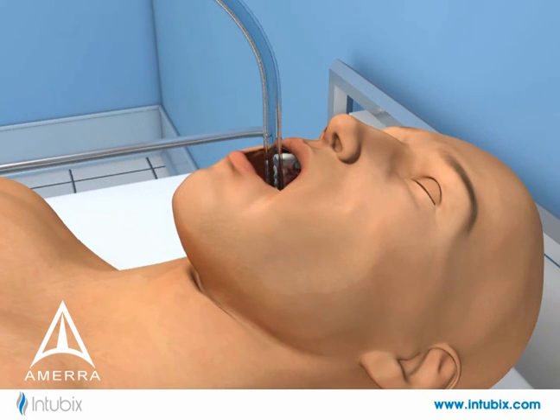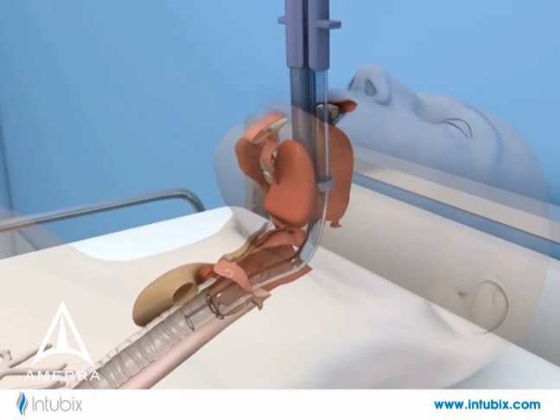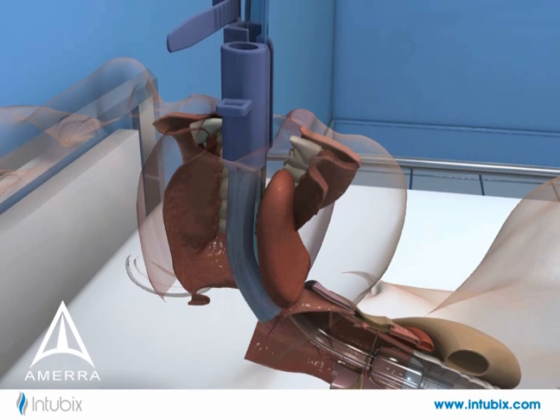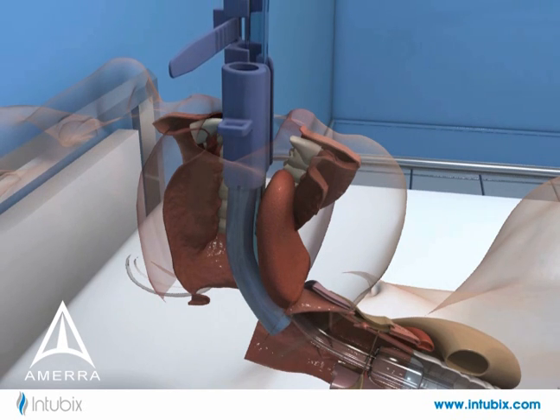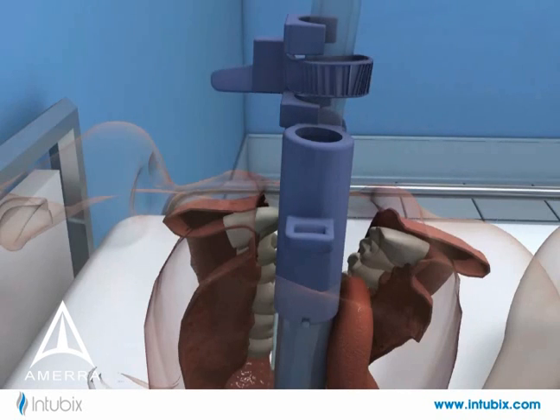Starting with a patient who has been intubated in the normal fashion, the Intubix device attaches to the ET tube distal clip first, and then the proximal clip slides on. The zip tie securely holds the ET tube in place, and a quick release allows easy adjustment of the ET tube's depth.